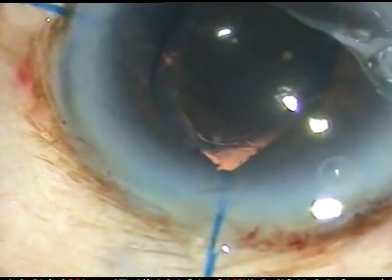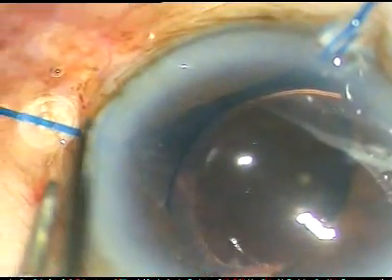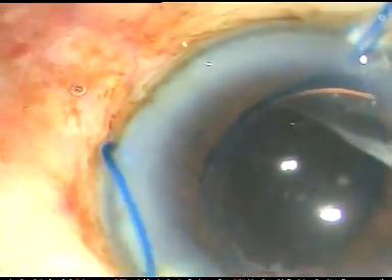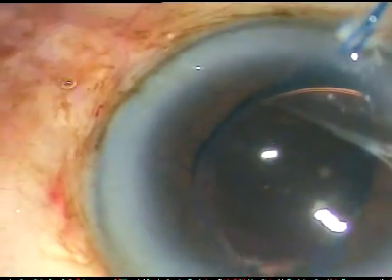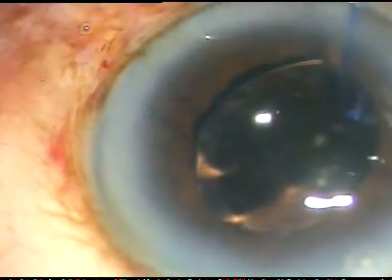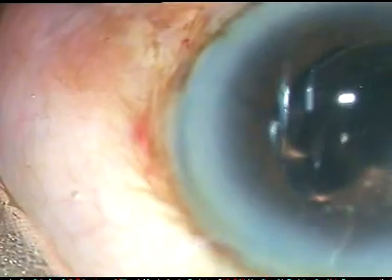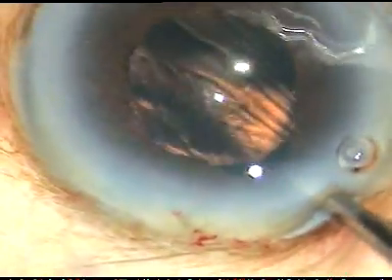Now I have to remove the hooks. How to remove the hooks? It is very easy — just retract the silicone guard, advance the hook, unhook the pupillary margin and remove the hook. You can use any kind of pupil expansion device, but this is the most widely used in India and it is very economical. You just have to make very small stab incisions, less than 1 mm.